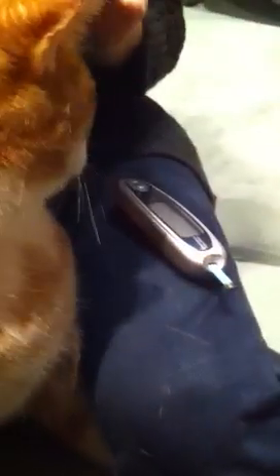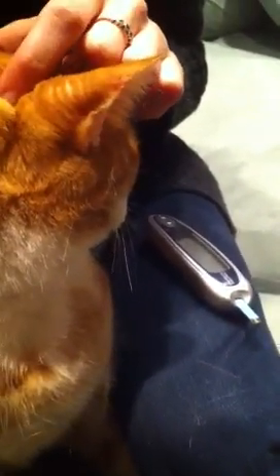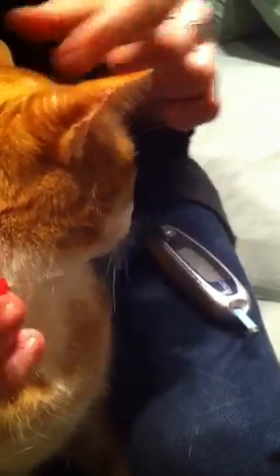I don't use the lancet that comes with the glucometer. I use a needle, which you can get from your veterinarian. This is a 25-gauge needle, and it just works better — it works every time, never have a problem, and doesn't appear to cause any more discomfort than using the lancet.